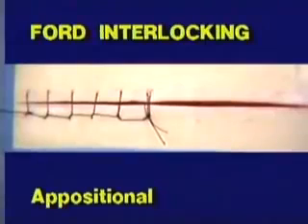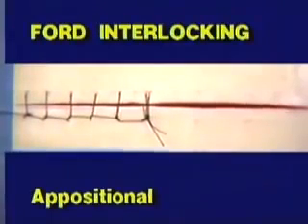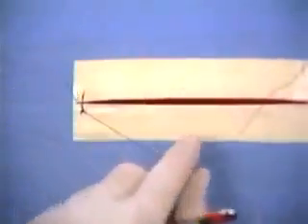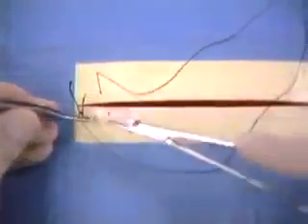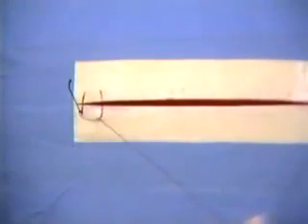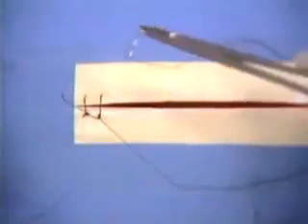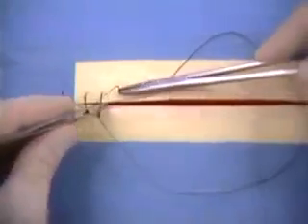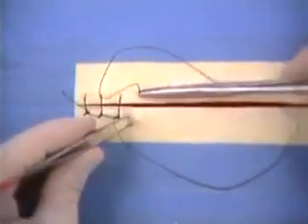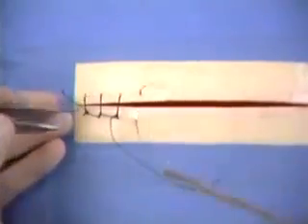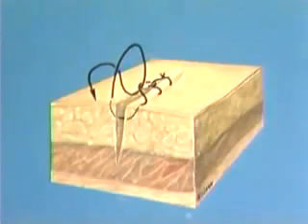The fourth pattern to be demonstrated is the forward interlocking pattern. This is an appositional suture pattern. The forward interlocking suture is a modification of the simple continuous suture. The beginning of the suture is as described for the simple continuous suture. The needle is advanced, a loop is formed, and the needle is passed perpendicularly through the tissues in the same direction. After the needle is passed from the tissues, it is drawn through the preformed loop and tightened. The pattern is repeated for the length of the incision.